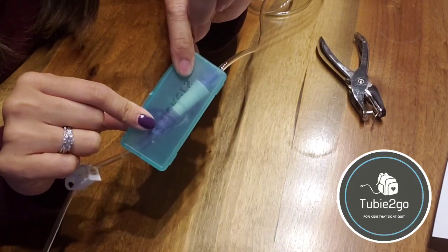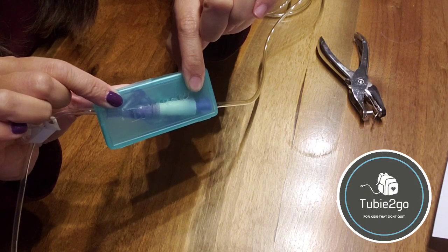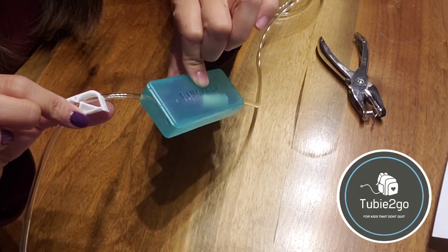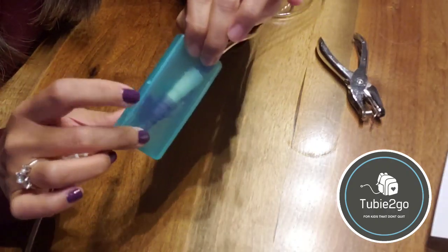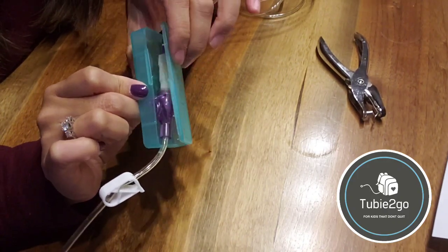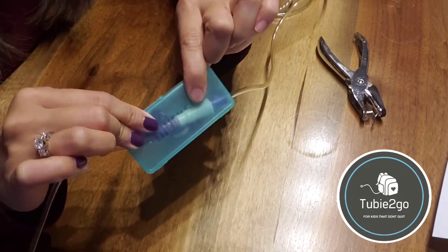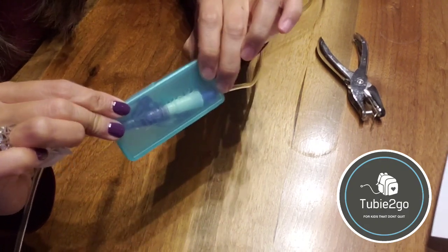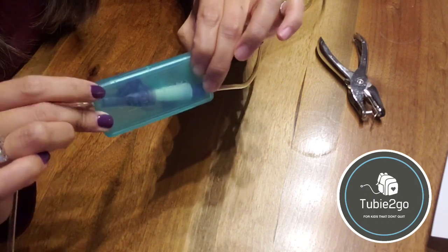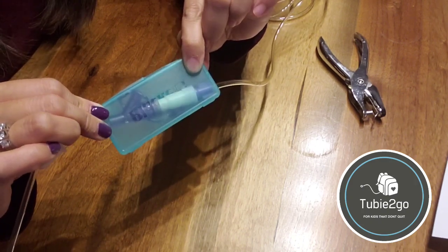Once you have it enclosed in there, then again, very similar to what some of the other solutions are, the two connections are in theory not going to snap apart. I will say that this is slightly too short, so the cap kind of wants to pop open, so this is not a suitable solution unless I tape it shut, but this is just to demonstrate a DIY option where if you can find a suitable container, then you can really craft your own solution for disconnecting ports.